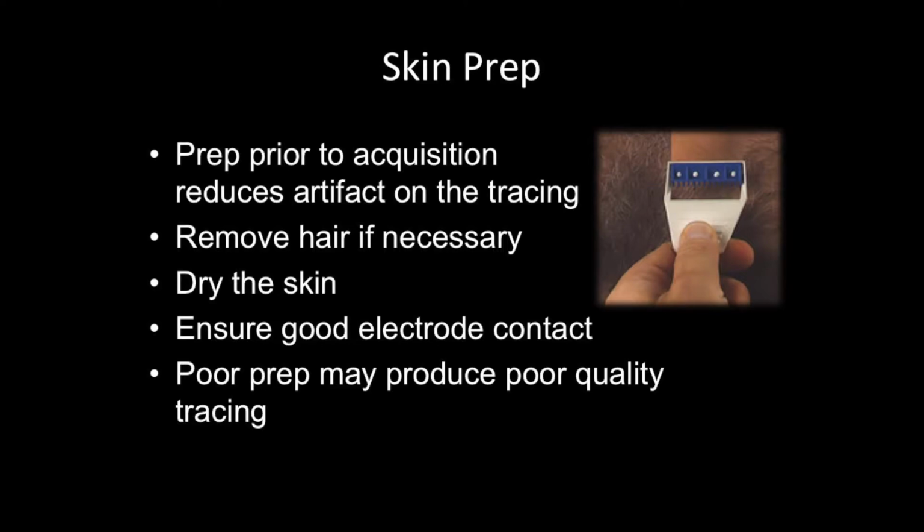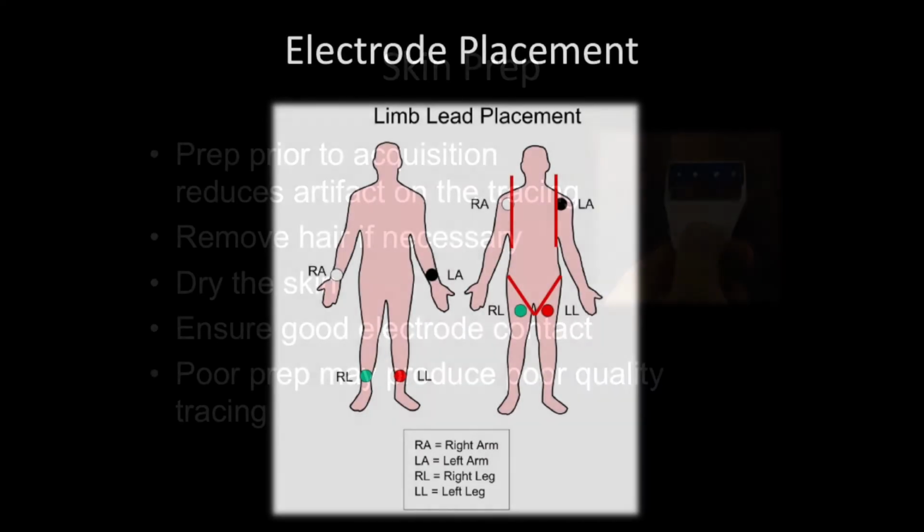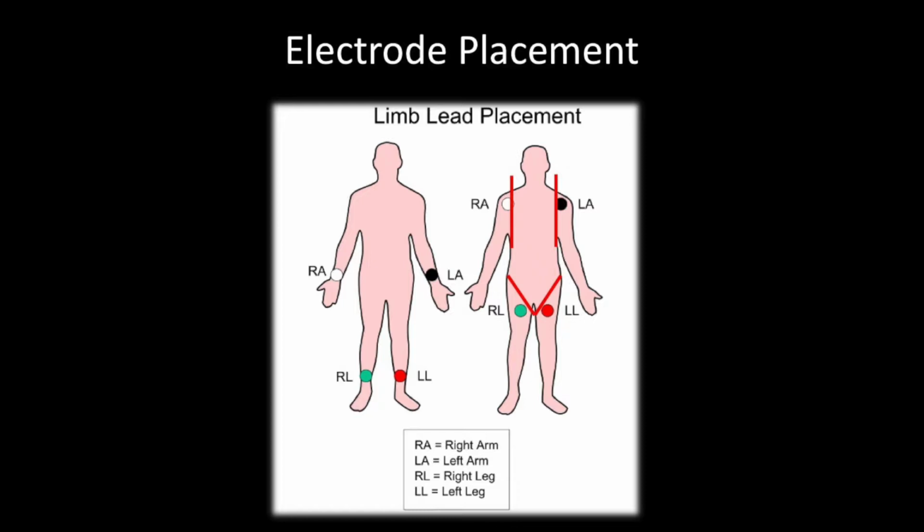Okay. All right, what is this? Correct. What kind of leads are those? Limb leads, very good. So when in doubt, look at the slide. It's going to be on the slide, okay? That's always a good bet. What leads are these? Okay, so these are limb leads. So are we going to do this one or this one? Does it matter? The closer the better. Why?